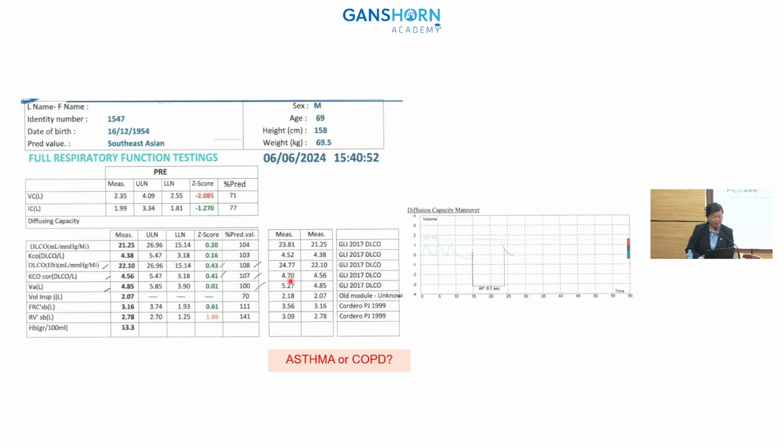And then we go to the DLCO. DLCO, KCO, VA, all of them are normal. So, COPD or asthma?